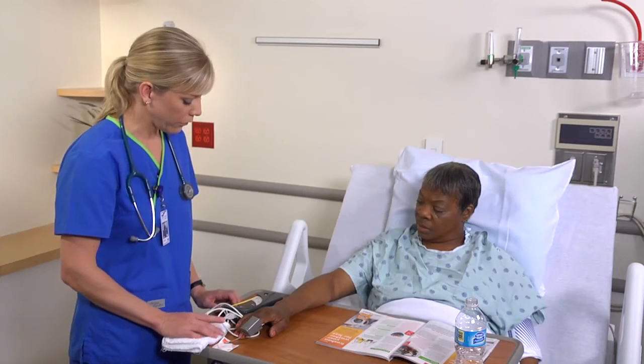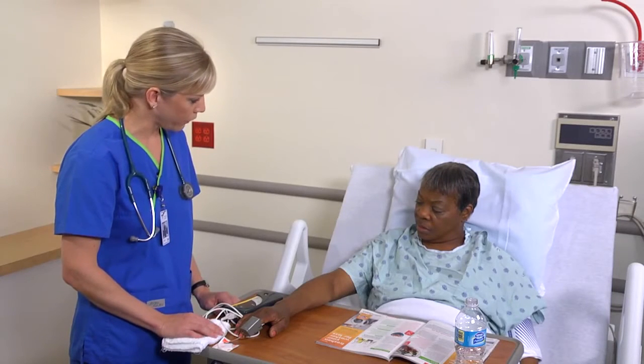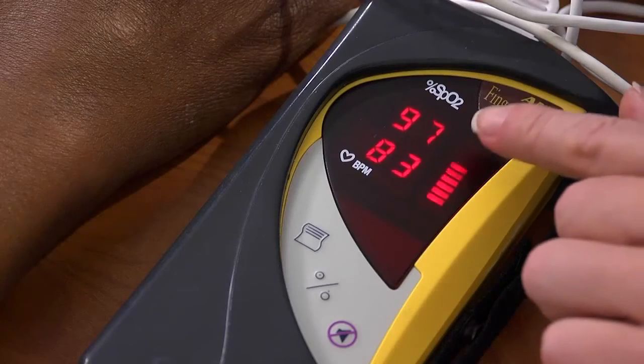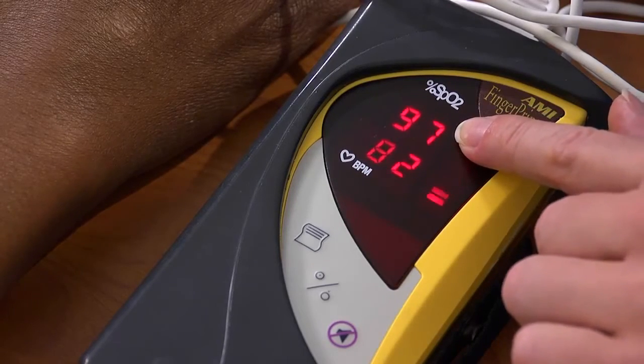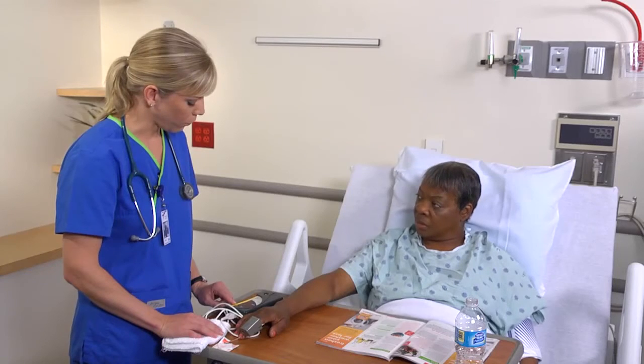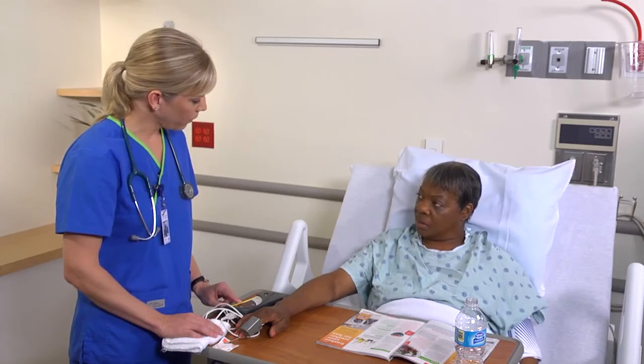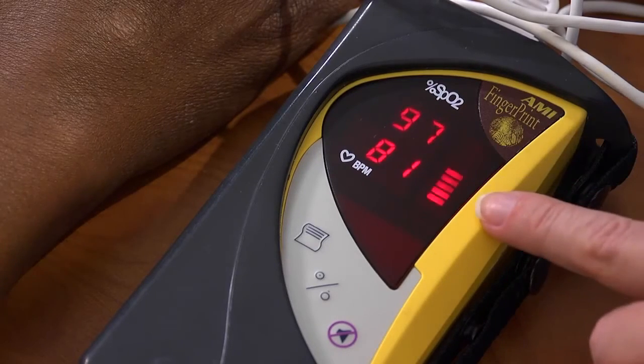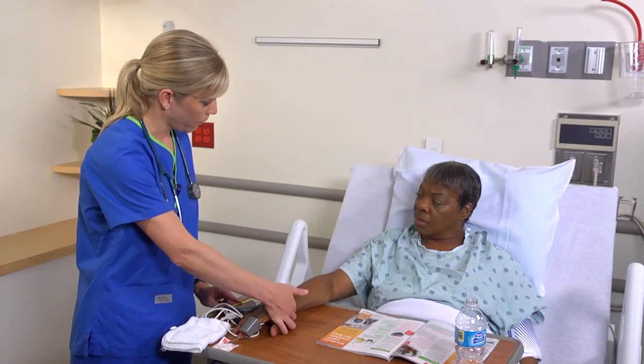So this is a pulse oximeter. What it does is it uses light to measure how much oxygen is attached to hemoglobin in your blood — and that's going to be this top number here. Leave the sensor in place until the oximeter reading is constant and the pulse display reaches full strength during each cardiac cycle. The bottom number is your heart rate. 60 to 100 is a normal heart rate. Now I'm just going to palpate your radial pulse and compare the heart rate I have palpating your pulse with the number the machine is giving me.